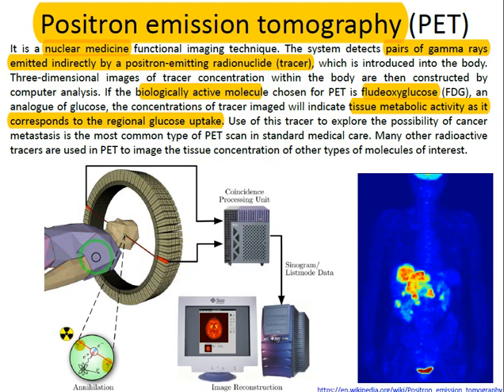The second problem is that these nuclides have to be in a short distance of the tumor tissue. So we need to use a vehicle, something which guarantees that these nuclides are going into the tissue.